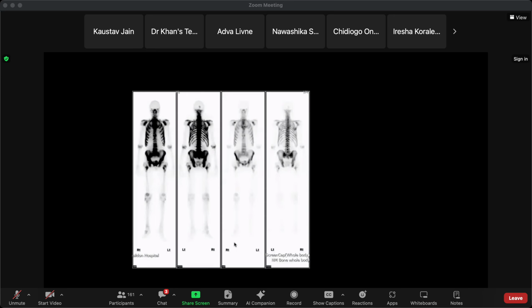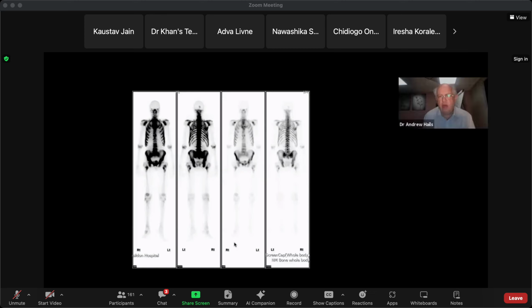Again, in my differentials, I'll include significant metastases from a primary, or if there has been a recent radiation or a treatment, then that can signify this appearance as well. I don't see anything in the kidney. So this is actually in keeping with the super scan, which is different to what I saw previously. So again, metastases with the super scan is my foremost differential, and other causes such as metabolic causes will be lower down my list. Okay.